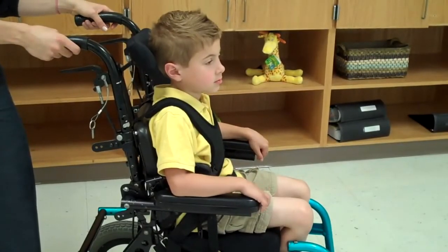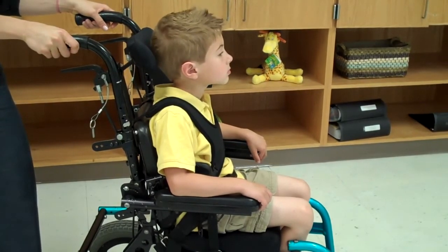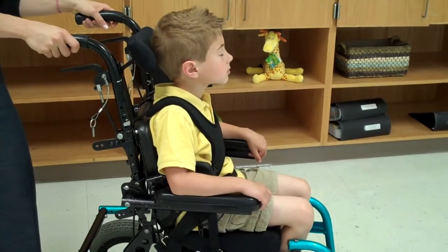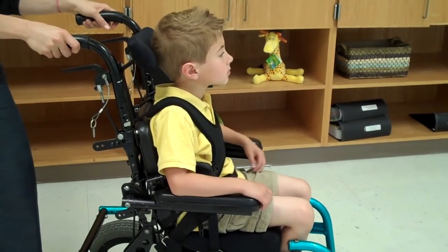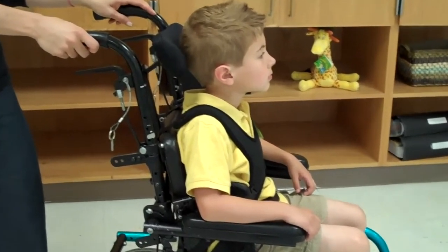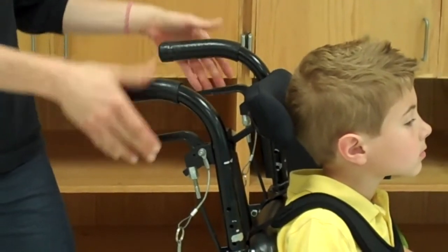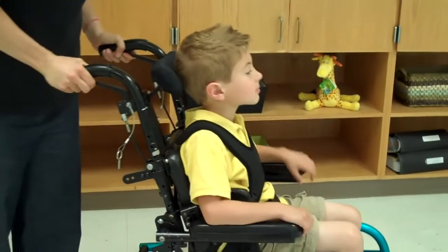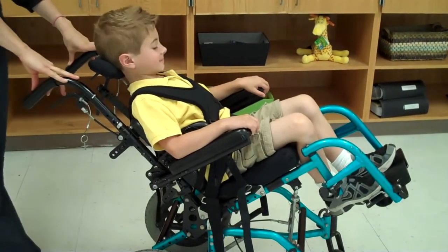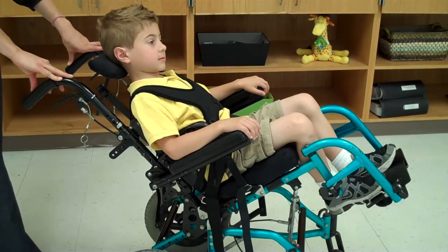Some wheelchairs have a tilt mechanism that can be used to give pressure relief to the student's sacrum or bottom after they've been sitting upright for long periods of time at school. Some wheelchairs will have this tilt control in the back, which you can control with a foot lever. This wheelchair, the tilt release is located on the back canes. When a student is in tilt, it can make the wheelchair more unstable. You can be tempted to hang heavy backpacks on the wheelchair handles, but this increases the risk for tipping and can eventually cause damage to the wheelchair.